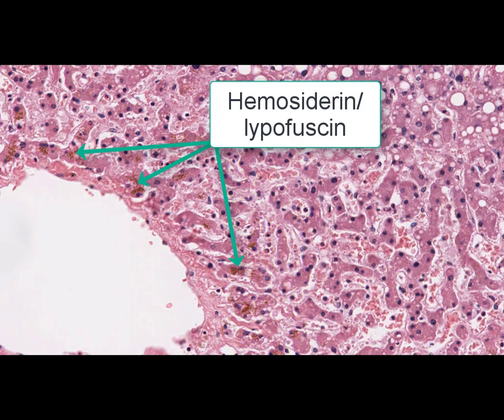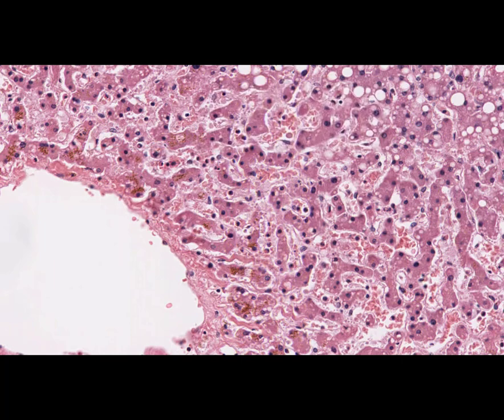These microscopic changes in the central lobular and periportal zones of the hepatic lobules are related to the appropriate macroscopic appearance of nutmeg liver. So, on the yellow background due to fatty degeneration, there are spots of dark red color due to hemorrhages, hemosiderin accumulation, and central lobular necrosis. The outcome of such condition is so-called nutmeg cirrhosis, which happens due to progressive growth of the fibrous connective tissue.